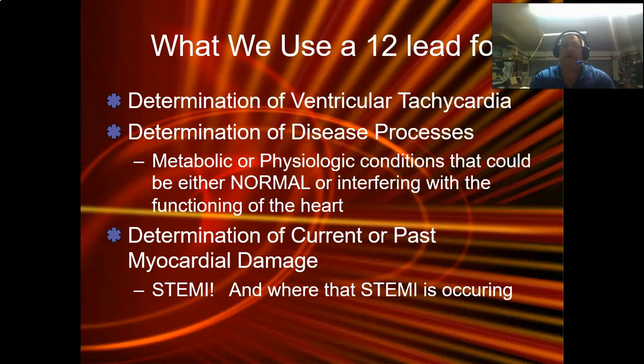And it's the determination of if the patient is having an ST elevation MI, which, again, is our primary reason that we will put somebody on a 12 lead. But understand that a 12 lead shows us a lot more than that, okay?